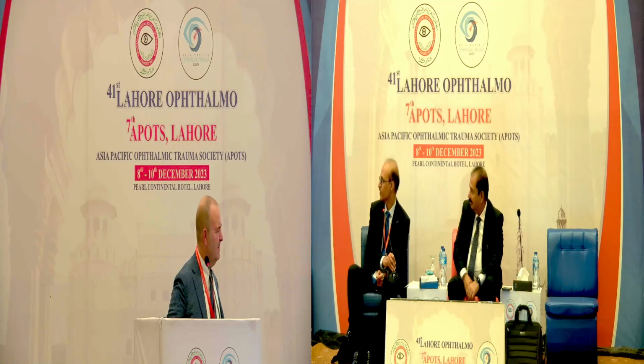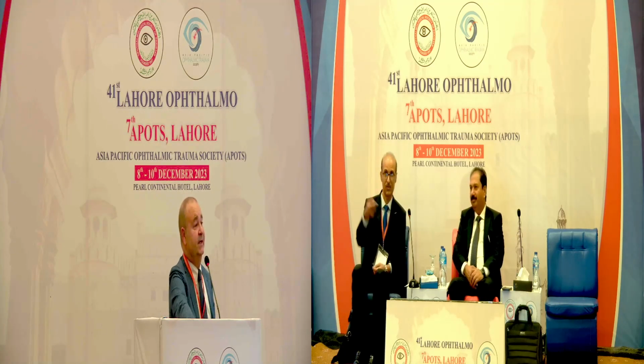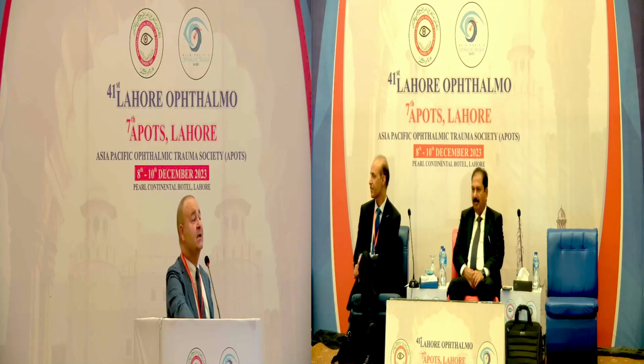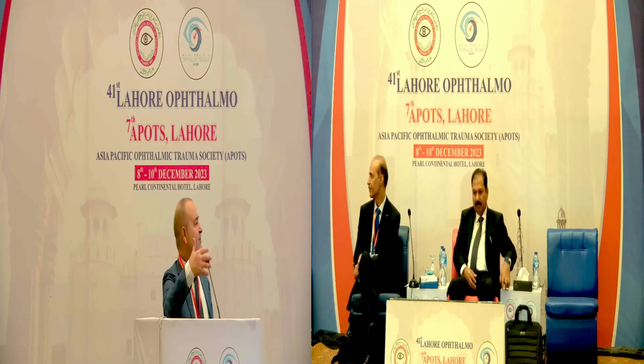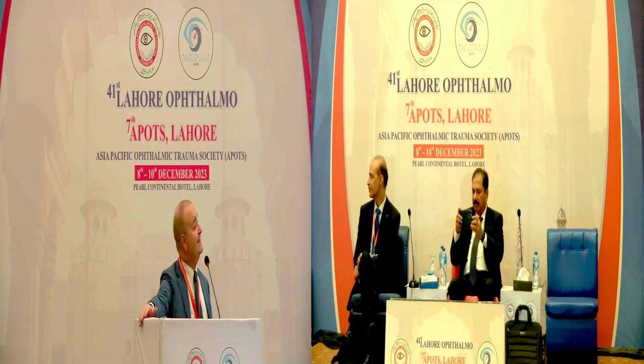Yes, I think you heard, the most common procedure all around is the Yamane. Because Yamane is comfortable because you use a lens that you already have in your stock. You have 3-piece lenses, so you have them in your stock, so it's easy.